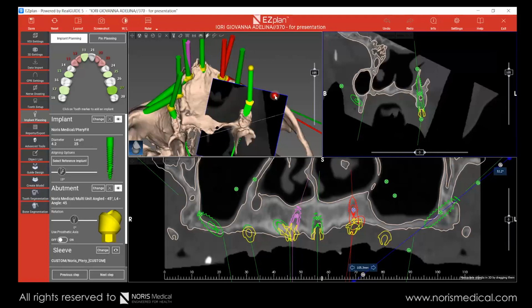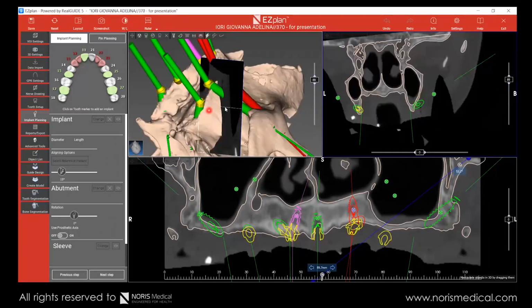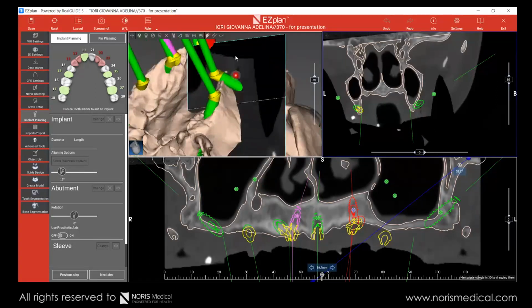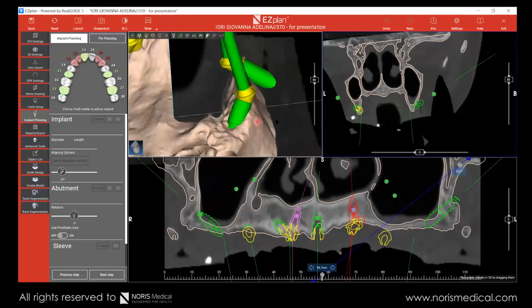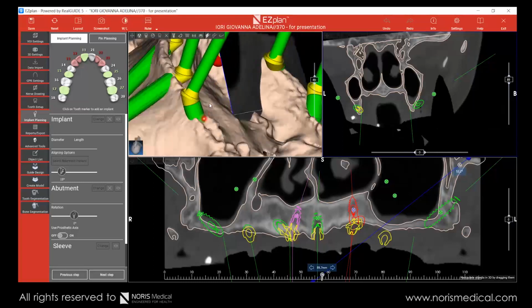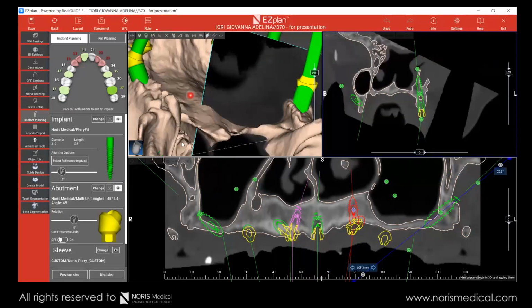You see what I said before, we actually have the pterygoid leaning on the crest. This here is machined. We don't need this to be with surface finish. We need this to be machined, okay, because it's outside of the bone because of the angle that it is. This is the reason it's very important to leave a pterygoid implant with machined surface here, okay?